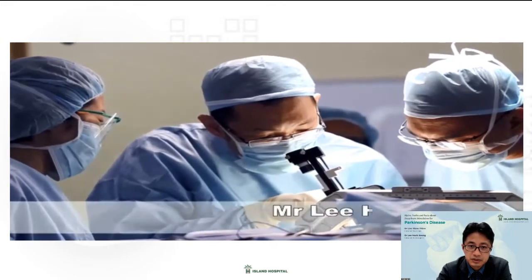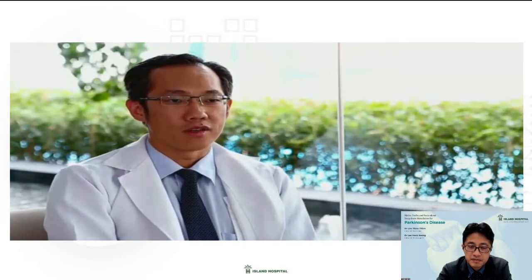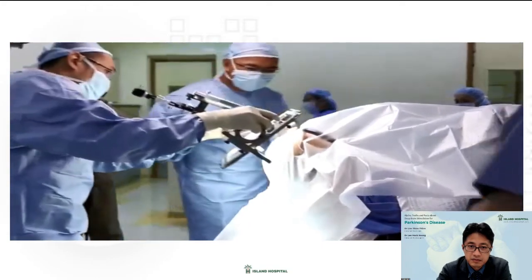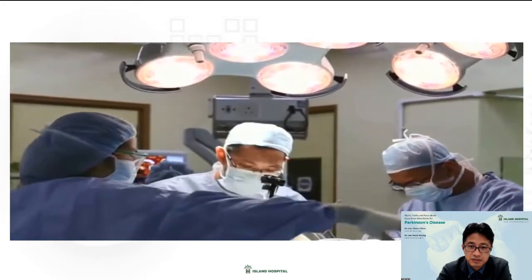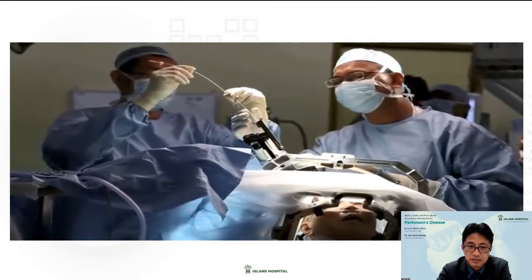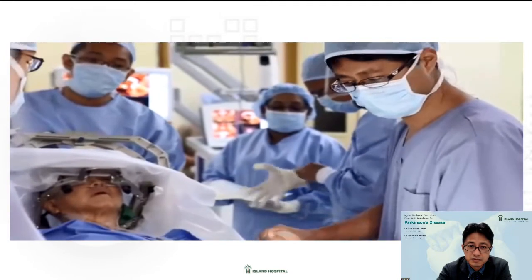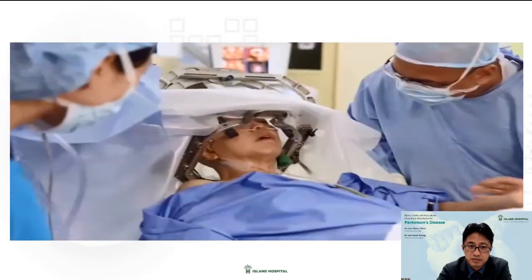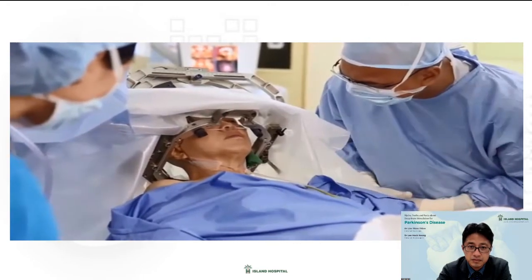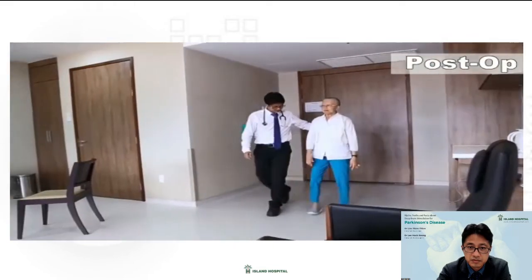There are many advances in the medical and the surgical treatments of movement disorder. DBS is a well-accepted surgical therapy of movement disorder like Parkinson's disease, essential tremors, and dystonia. It involves implantation of a small electrode, like the size of a spaghetti, into a motor nucleus, delivering a small amount of electric stimulation, blocking off abnormal nerve signals that are giving rise to the abnormal motor symptoms. The beauty of DBS is adjustable and reversible. The stimulation can be adjusted to the patient's demands.